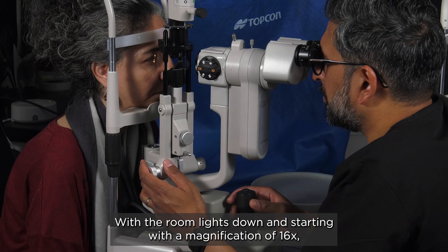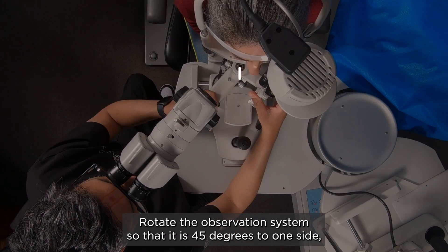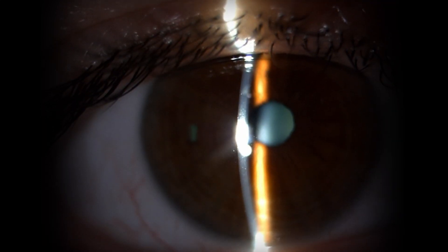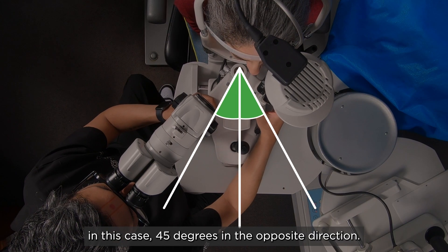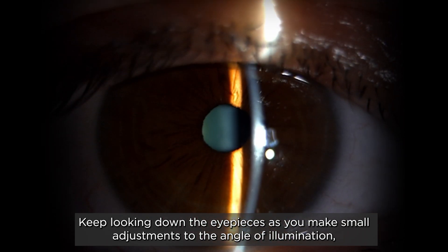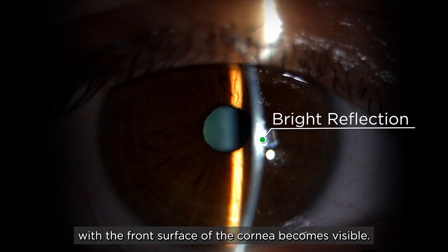With the room lights down and starting with a magnification of 16 times, focus a narrow parallel pipe slit beam on the area of the cornea to be examined. Rotate the observation system so that it is 45 degrees to one side and check that the view of the cornea is still in focus. The light source should then be rotated by an equal but opposite amount — in this case 45 degrees in the opposite direction. Keep looking down the eyepieces as you make small adjustments to the angle of illumination until a bright reflection coincident with the front surface of the cornea becomes visible.